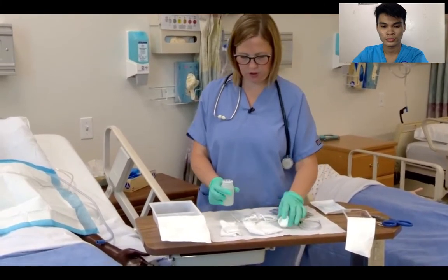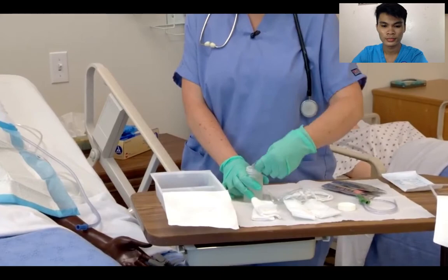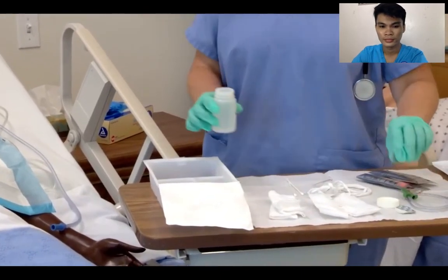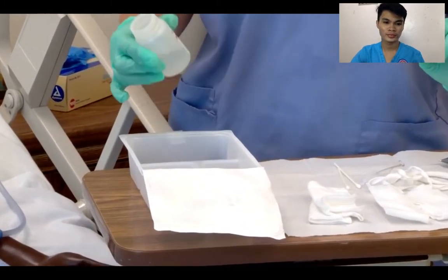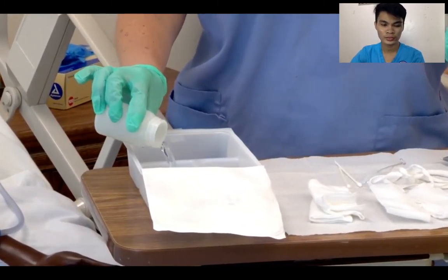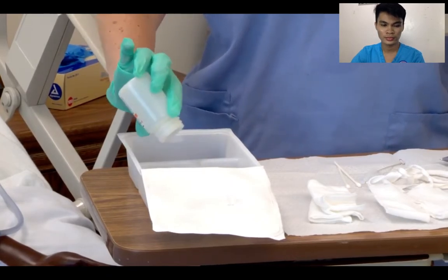Doing okay there, Mr. Jones? Okay, good. I'm looking at my pulse ox. I'm going to open this up. I'm going to pour 50% of the saline into the large compartment, and then the other 50% between the other two compartments. So 25 and 25 here. Okay.